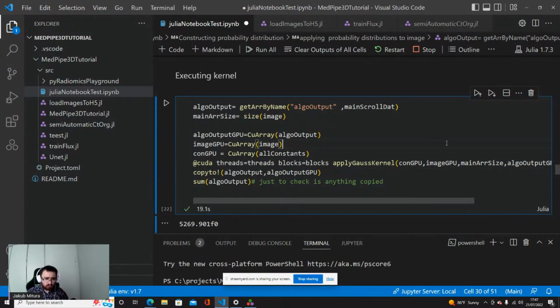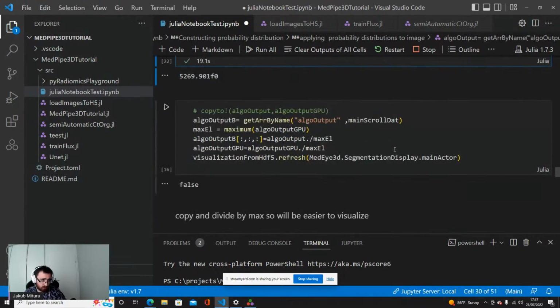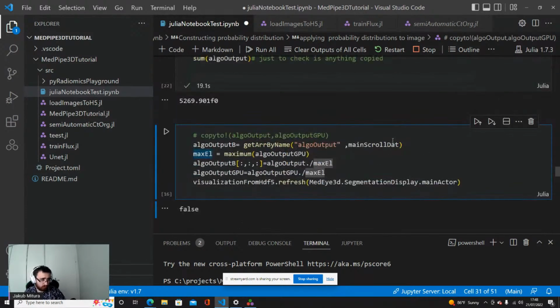For example, for training 3D neural networks, it will be problematic. We would need to create some mini batches. But this algorithm does not require a lot of memory, so there should be no problems, particularly with the Spleen dataset. I chose this and posted this because it has very small images that will not overrun your memory. But in some cases, of course, you need to patch the data into smaller pieces. But this algorithm was chosen to get a very low memory footprint, basically.